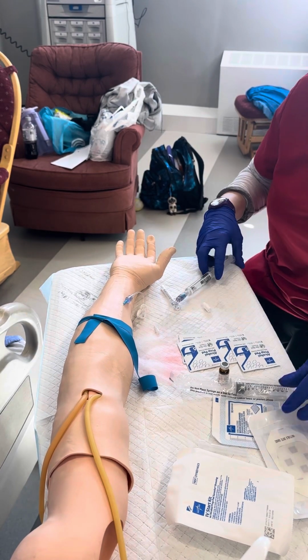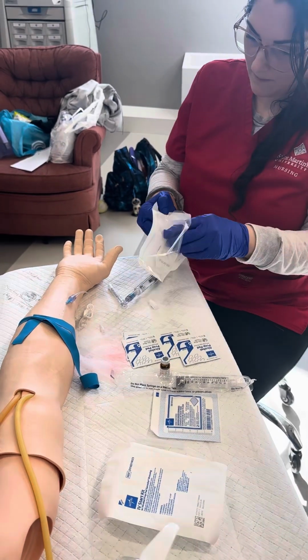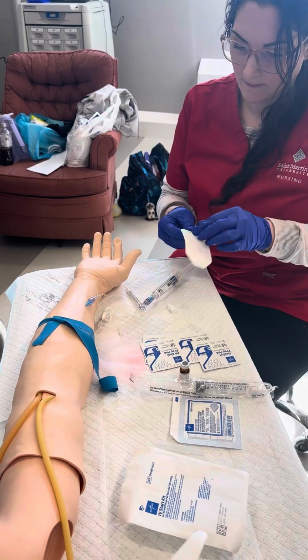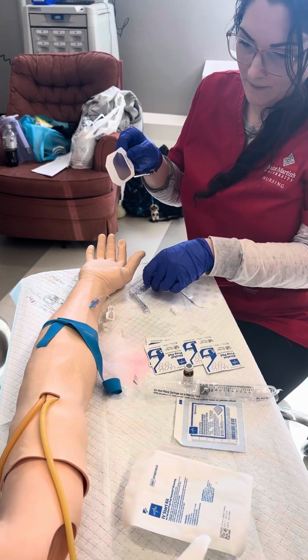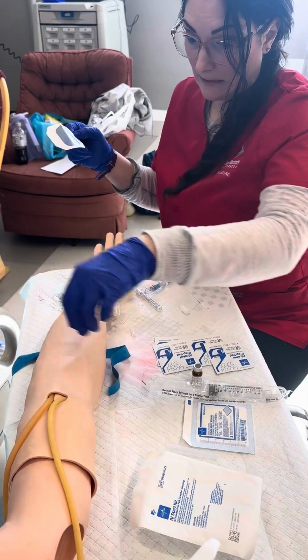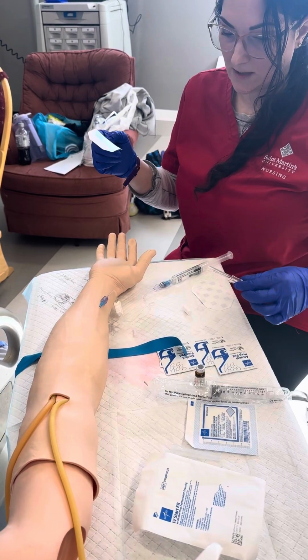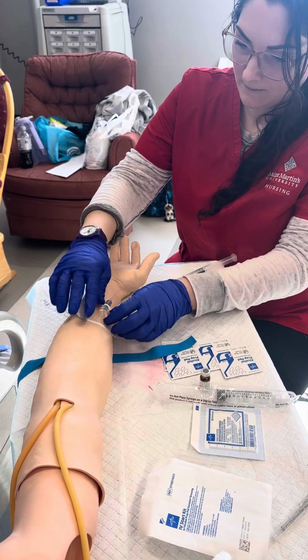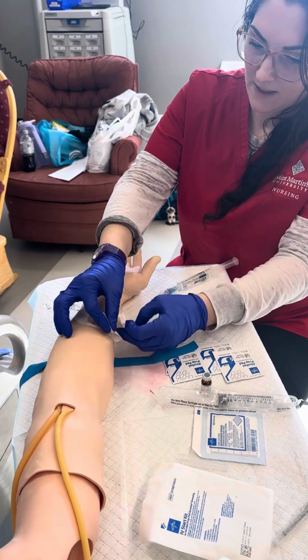All right, I have my label here. I'm going to go ahead and, oops, I forgot to do that. Take that off. This will be disposed in the sharps container. Put that over. All right, that was pretty easy.